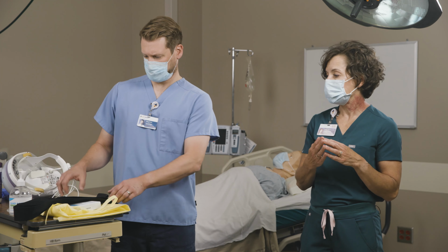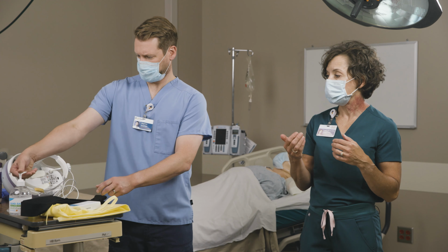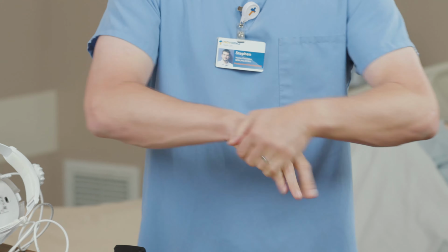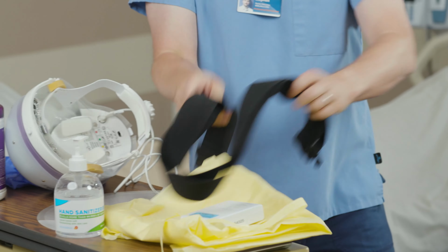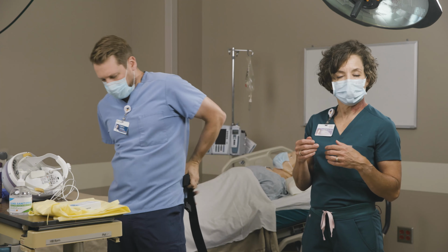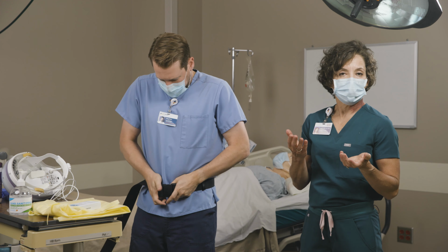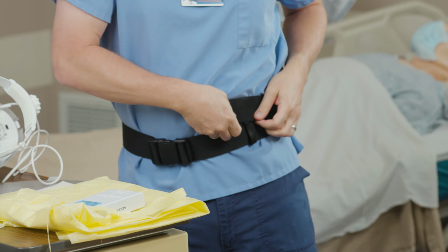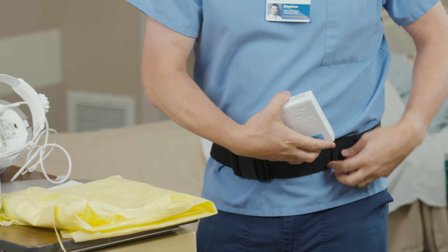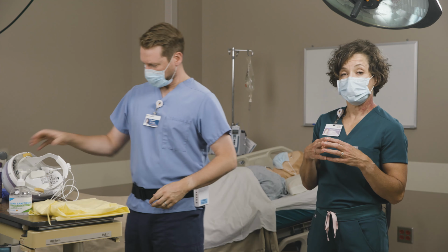So we're going to start as Stephen is going to perform hand hygiene. Now he's going to don his belt and then attach the battery to the belt. You're also welcome to put the battery in the pocket of your scrubs if that's preferable for you. Either way is fine. Now he's going to get his CAPR ready.